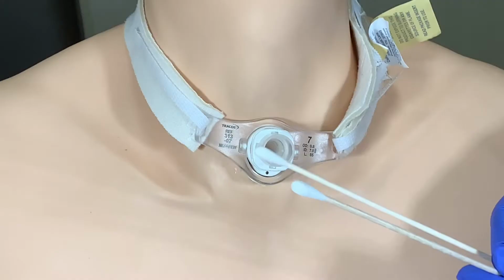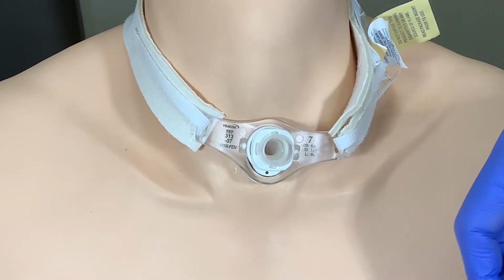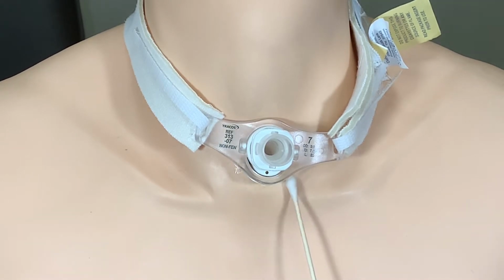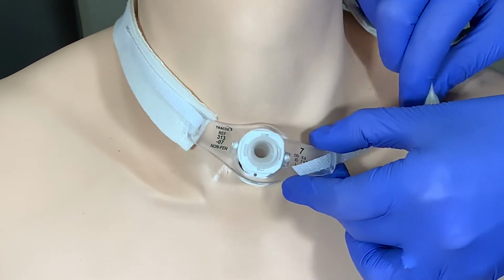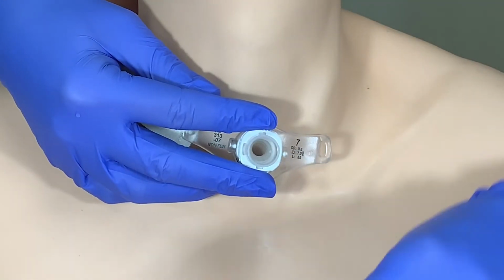To clean around your stoma, take a Q-tip or cotton-tipped applicator dipped in a mixture of half sterile or boiled water and hydrogen peroxide. Work the cotton-tipped applicator around and underneath the flanges of the tracheostomy tube to clean the skin. When you perform your tracheostomy tube changes, you will be able to see the stoma prior to putting the new tube in, and this provides additional opportunity to clean the area.